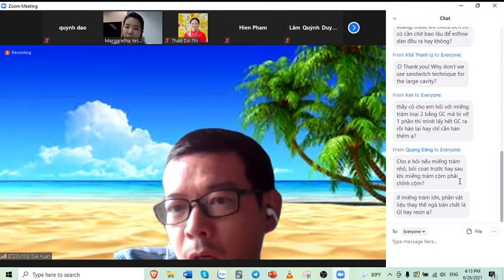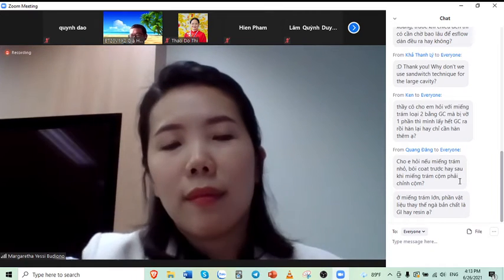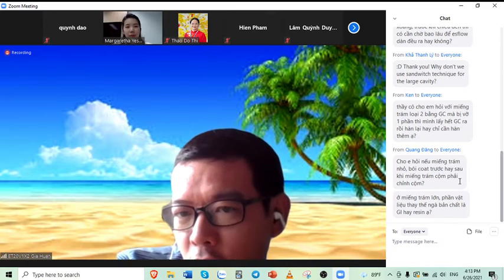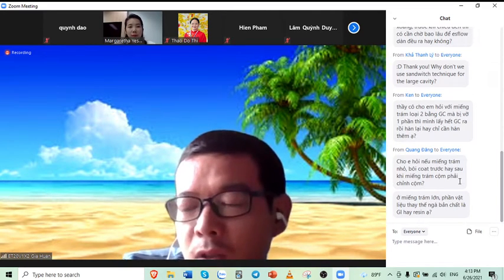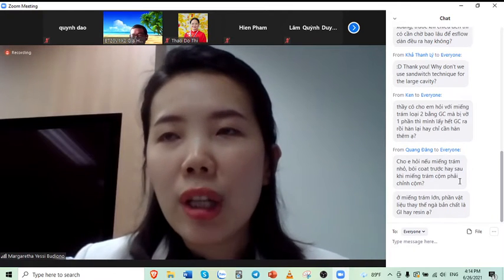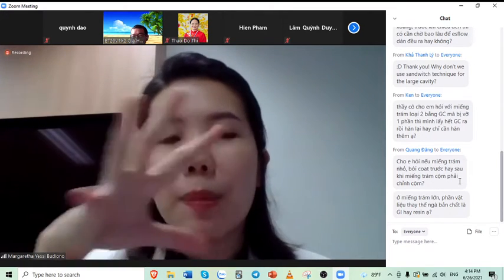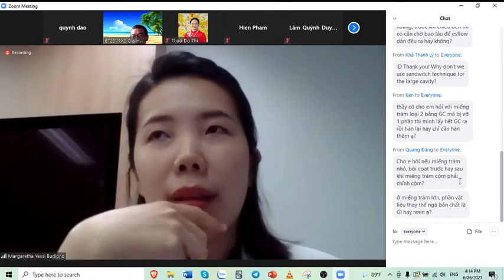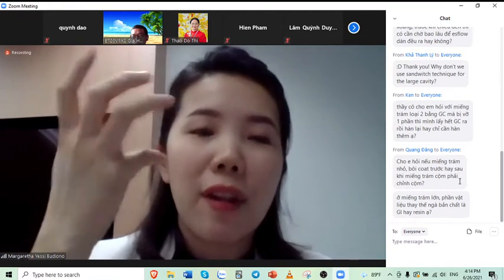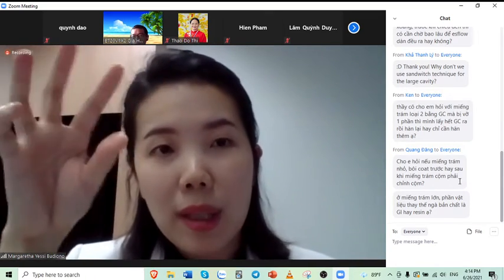If in case that we have a sandwich technique, we do not use the glass hybrid, we use Fuji IX. Okay, so do we need to etch before we put the composite on the GIC base? So the etching of GIC or glass hybrid in sandwich, right? I think it has been a controversial topic, but there are many research that prove that etching actually has a negative effect because it will lower the bond strength between the composite and the GIC.